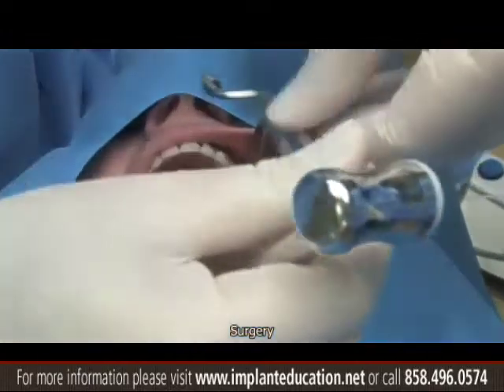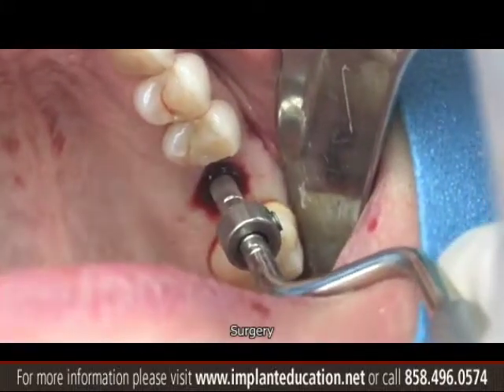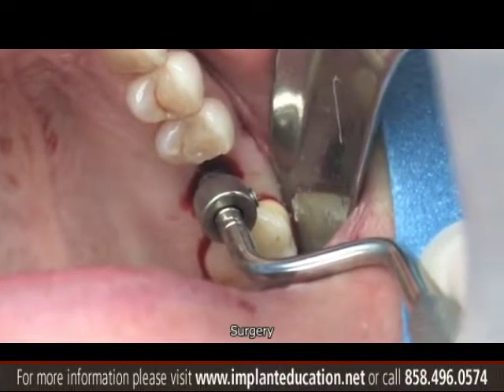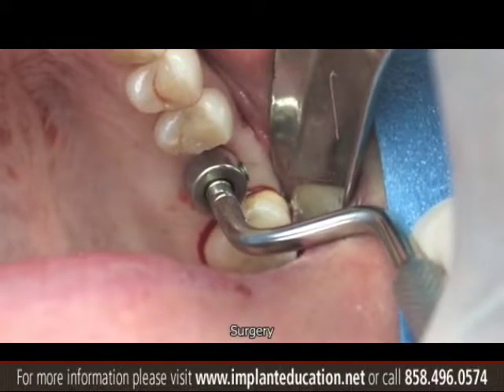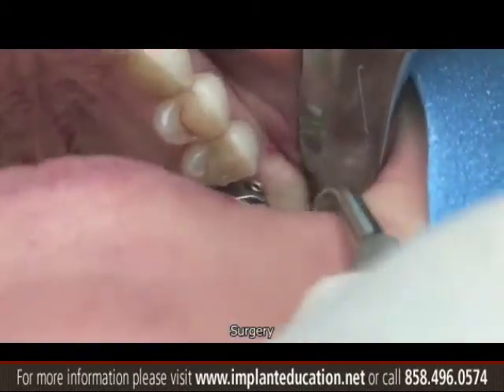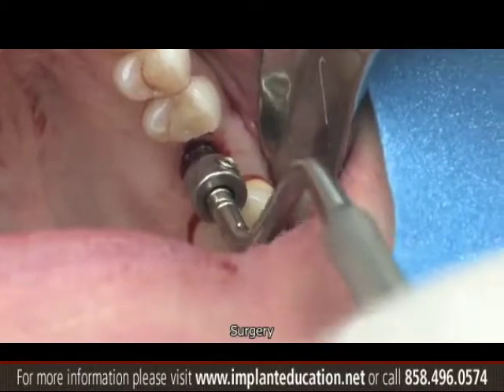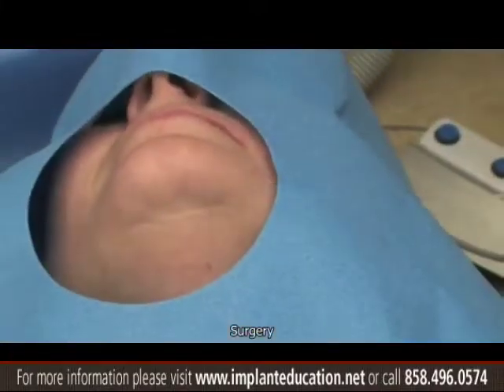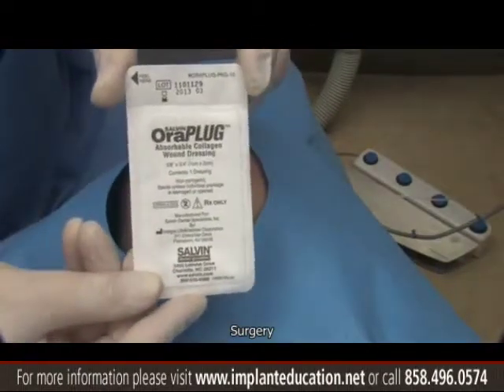Now we are done with the osteotomy — roughly up to 4mm. We now use the sinus osteotome. We need to go 10mm in bone; we have roughly 2mm of soft tissue, so we put the stopper at 12mm and go with the mallet until the stopper reaches the level of the soft tissue. The concave sinus osteotome is now roughly 2mm into the sinus cavity. Notice how we remove the sinus osteotome from the osteotomy — do not exert any lateral movements.